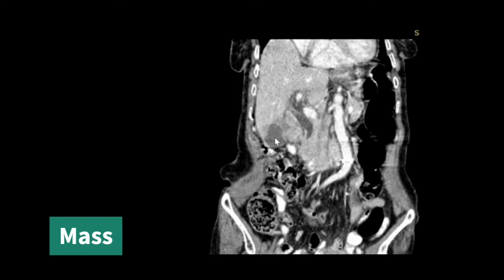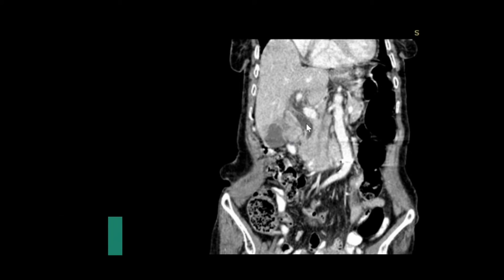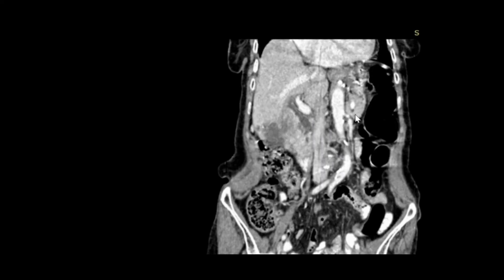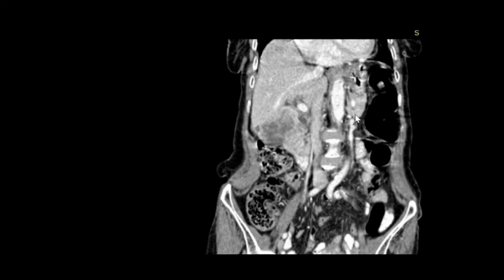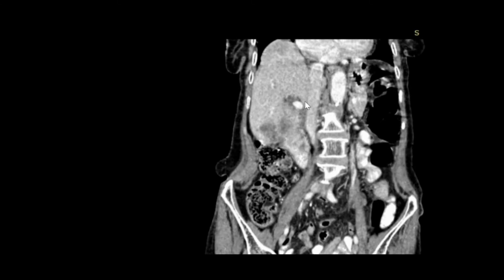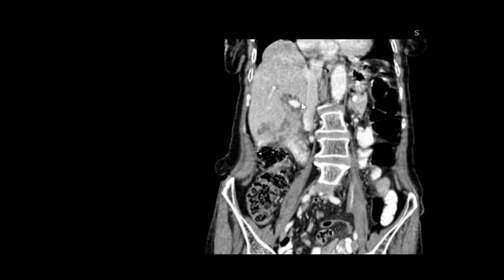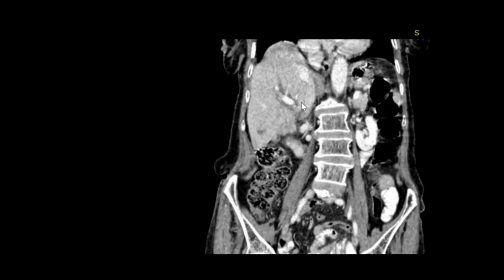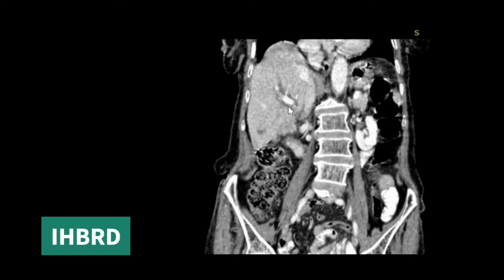You can see all those necrotic areas which we saw in the axial sections, and dilated CBD is also seen. Moving to more posterior sections, here we can see that ill-defined mass which has ill-defined margins with the liver — that is, liver is involved — and central IHBRD. Here we can see the IHBRD.